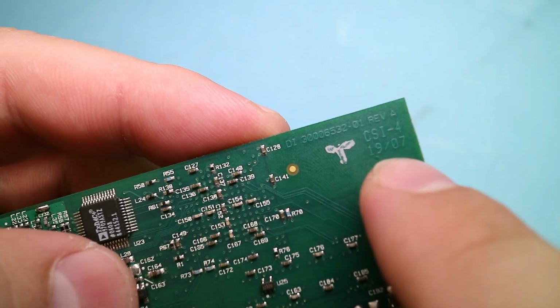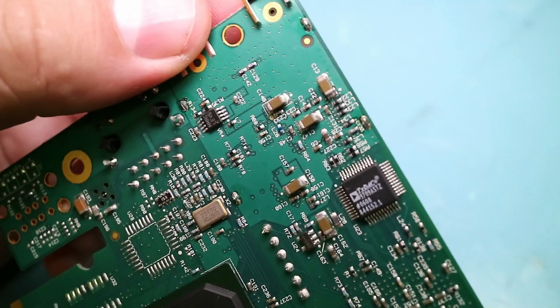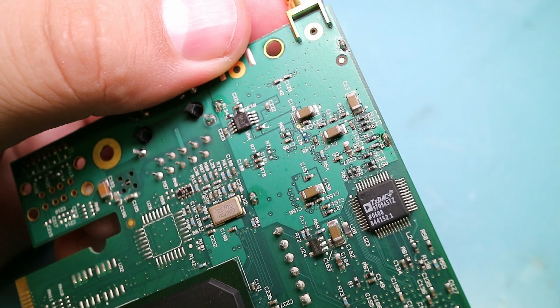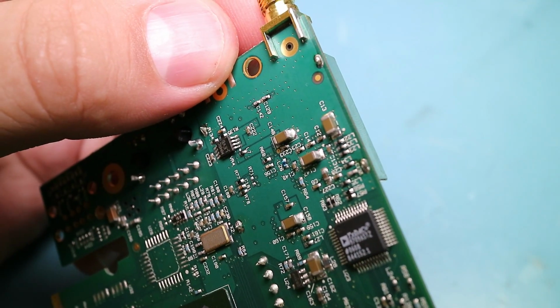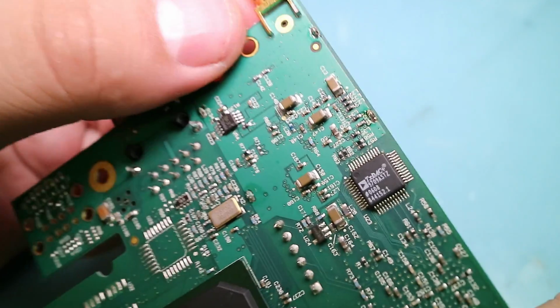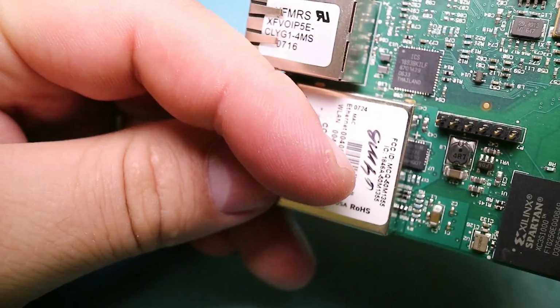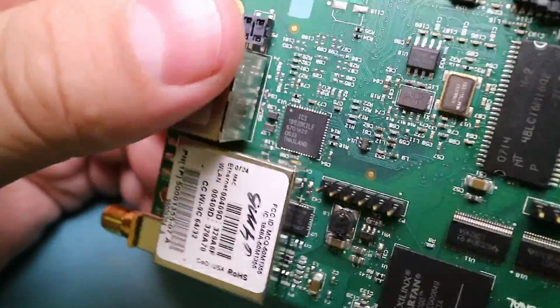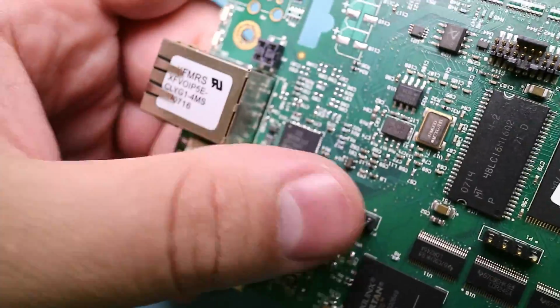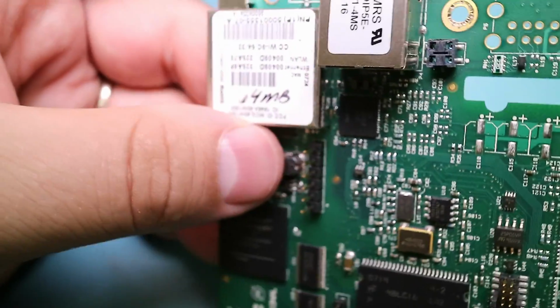Yeah, 1907, so 2007 fits with everything else on this thing. What is that? Oh, it's a DAC? Yeah, it's an Analog Devices DAC. I wonder what they're using that for. Probably more of the, well, it's by the Wi-Fi. I don't know. Maybe that's unrelated. It just happens to be there. Maybe it's for some of the analog outputs and stuff. But yeah, it's basically just a little board with a computer on it.